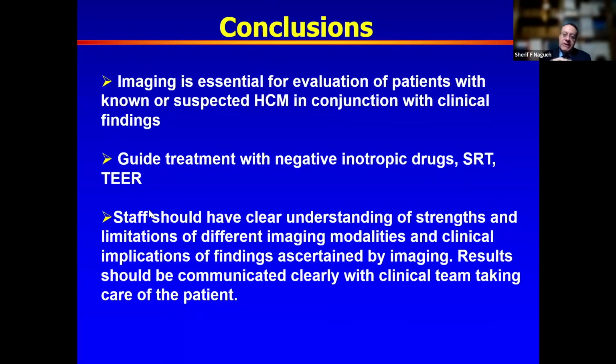If a sonographer is not familiar and comfortable with a supine bike, then asking them to do a supine bike would not be a good idea. If they are, and there is more information that is sought from the test, then maybe the supine bike. Like I said, theoretically, treadmill and exercising in an upright position has an edge, but in the clinical study that compared both, there wasn't much of a difference.